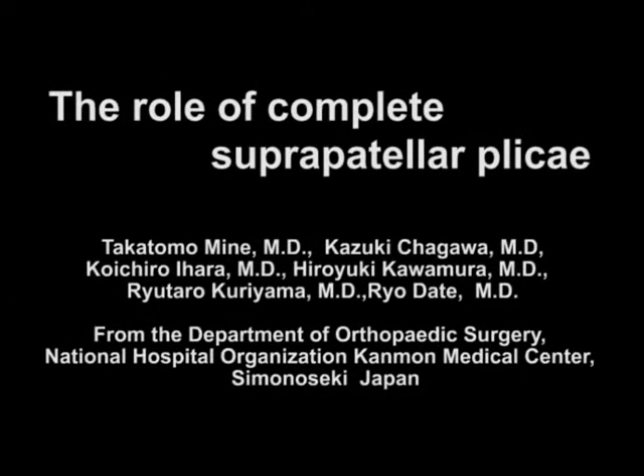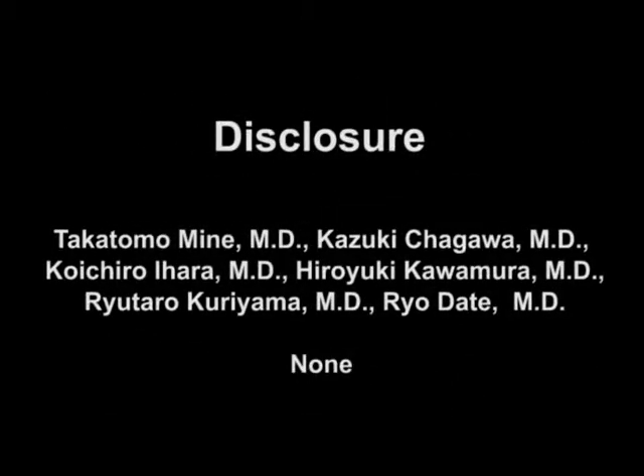Two cases of complete suprapatellar plicae: arthroscopic diagnosis and treatment.